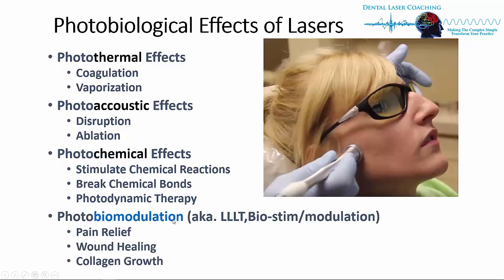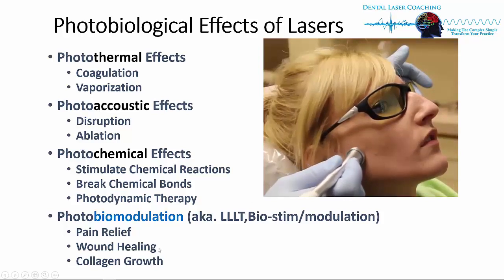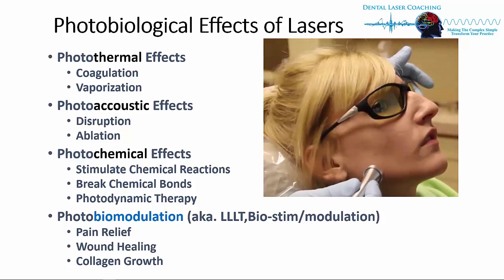And then photobiomodulation. This is known by many names. Biomodulation is what we're going by now. Photobiomodulation, some people know it as cold lasers. Low-level laser therapy, that's what LLLT is. Biostimulation or biomodulation. But in essence, it's non-cutting. It gives you pain relief, wound healing, and stimulates collagen growth. You can use this before surgery and immediately post-op. It gets the body prepared, and then post-op it expedites healing. This may sound hocus pocus, but the science is there and the results are truly amazing. In South America, they did studies with open heart surgeries where they treated with a low-level laser immediately prior and immediately afterwards, and there was no scarring. It does expedite healing. I highly recommend that you try this laser technology.